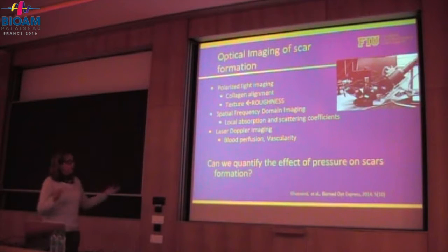I won't go into the depth of the study, but I'll just give you an overview of what we did. So we looked at absorption and scattering coefficient with the SFDI, spatial frequency domain imaging. And also we looked at perfusion using laser Doppler imaging. So the thought was, can we quantify the effect of pressure on scar formation? Pressure is the general way that physicians use these days to limit the growth of the hypertrophic scars.